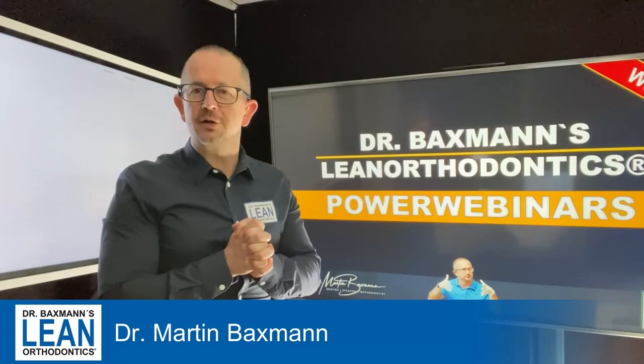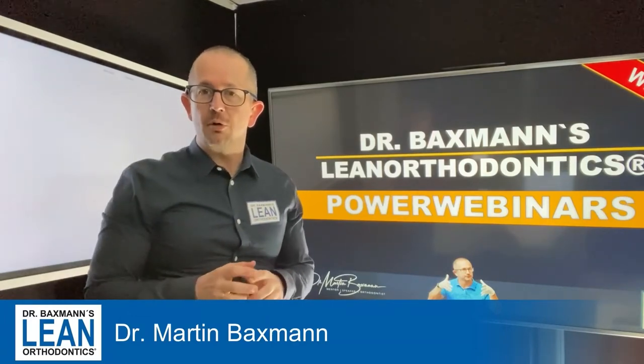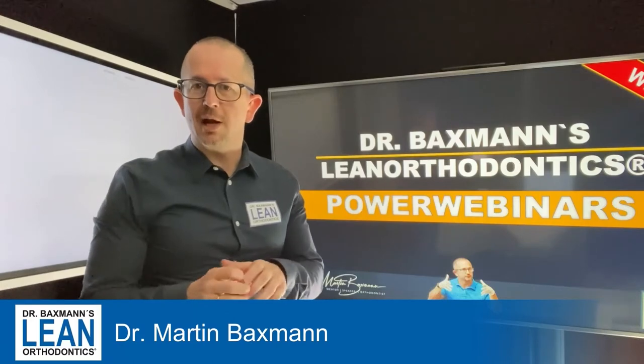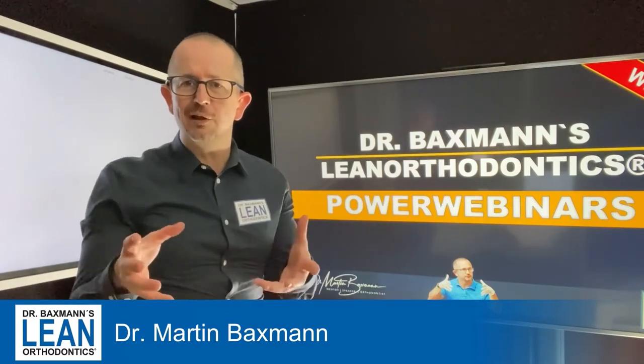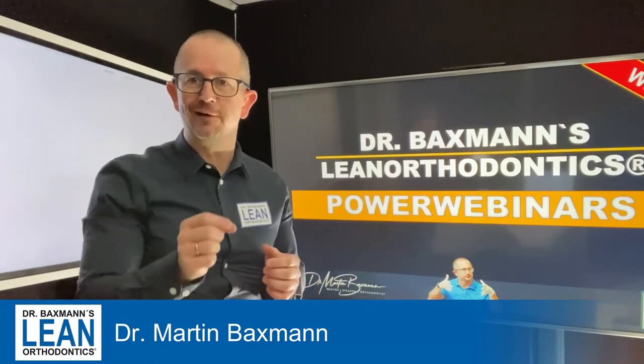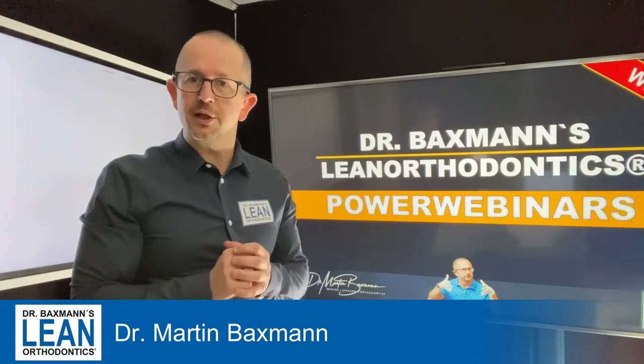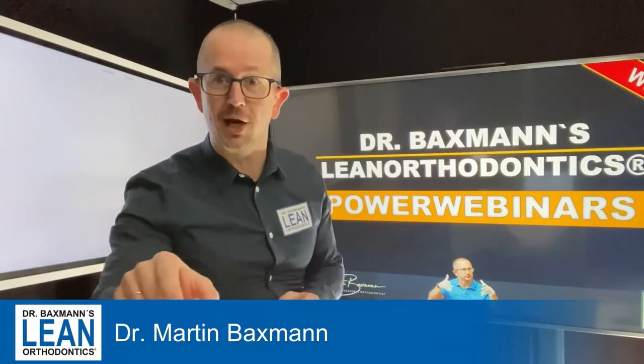Welcome to my power webinar series in lean orthodontics. My name is Dr. Martin Baxmann. Our patient still has a little bit of a Class 2 remaining, so what we are going to do is use the Power Scope to fit it in and advance the mandible and the lower teeth a little bit. Let's get down to action.